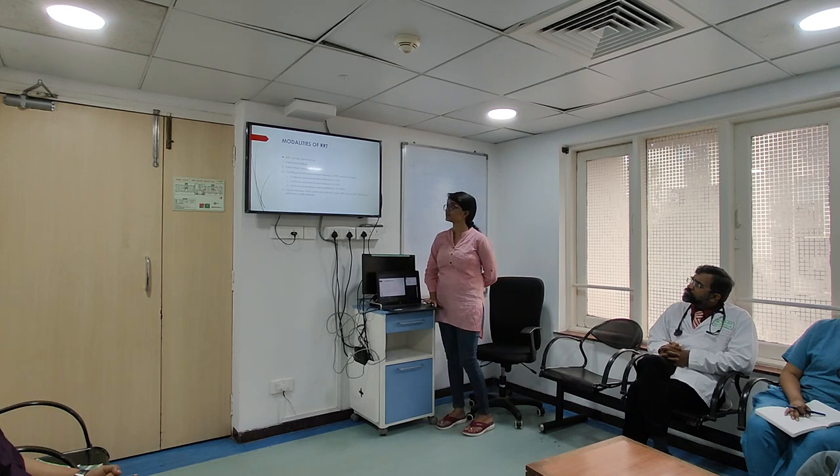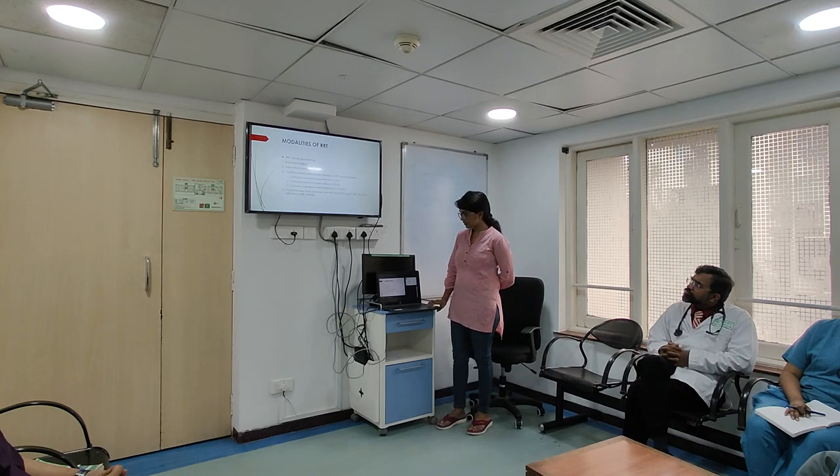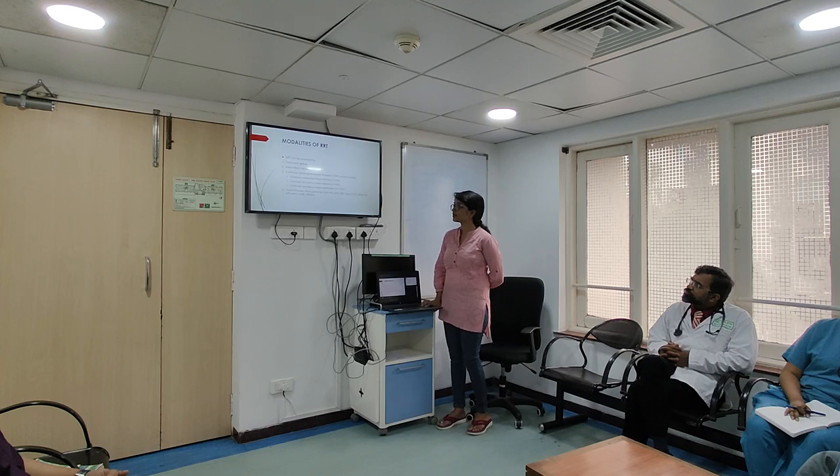Then modalities. There are different modalities. We use peritoneal dialysis, intermittent hemodialysis, continuous renal replacement therapy, and hybrid therapy that combines both IHD and CRRT.